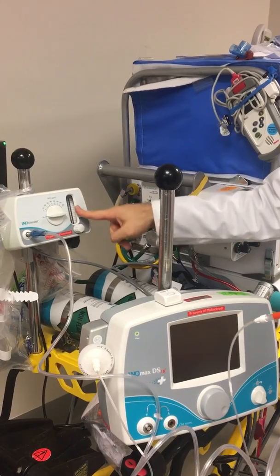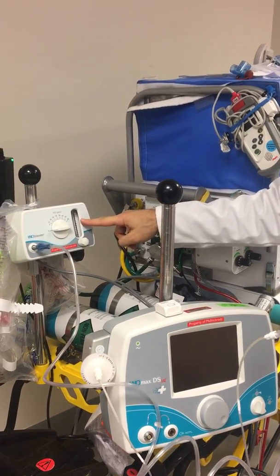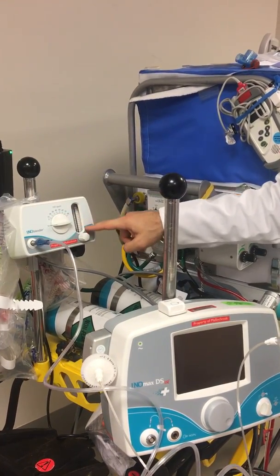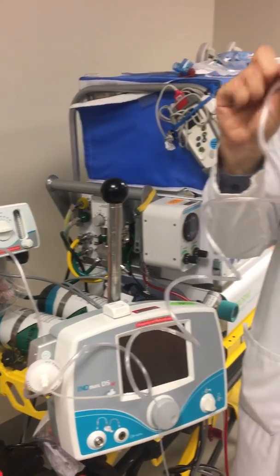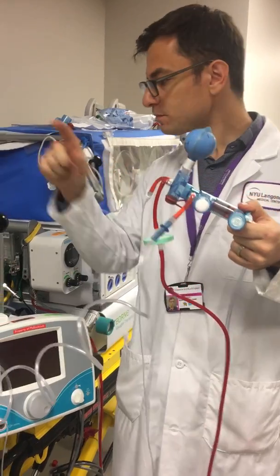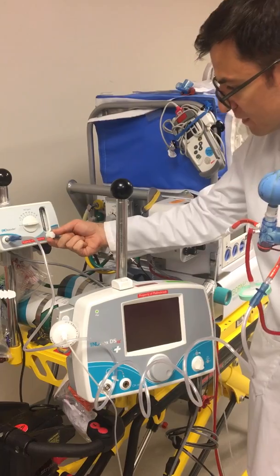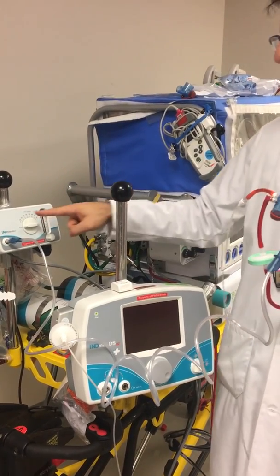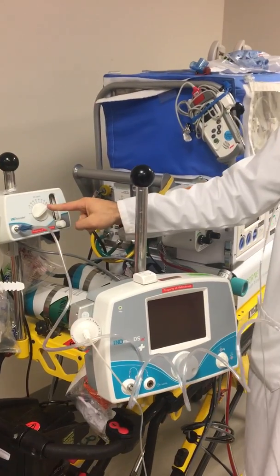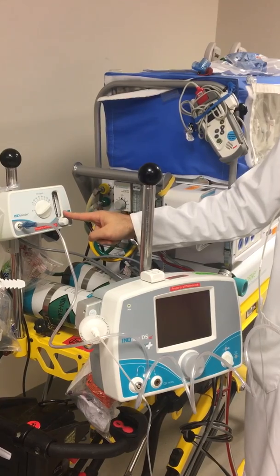Typically for inoblender use we would do 10 liters of flow and 20 parts per million to deliver 20 ppm. However, we are not going to deliver 10 liters of flow through here — we're going to deliver much less, about three to five liters of flow. So at three liters of flow, if we want to deliver 20 parts per million, we're going to crank up to 80 and fully max out our concentration but only deliver at three liters.